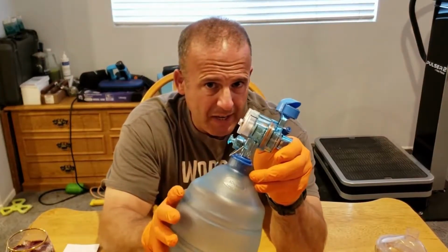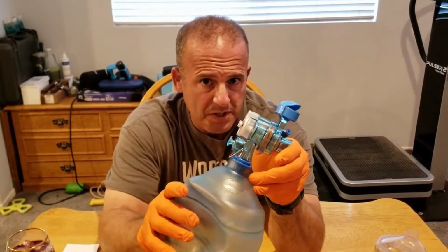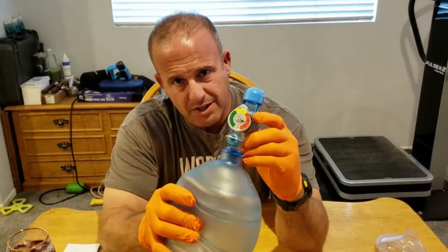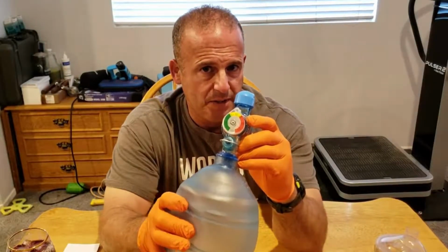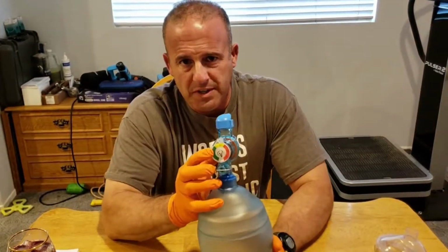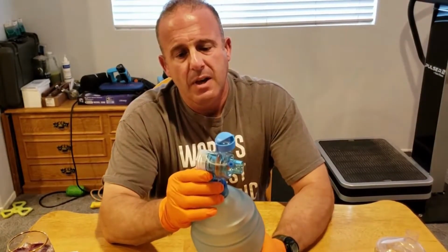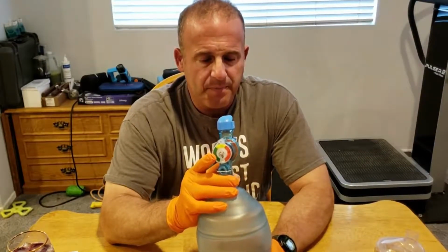If you're bagging a newborn, a neonate, and they had high resistance to breathing, you can bypass that by taking this little clip. And now, no matter how hard I squeeze, you'll see the arrow pegs out in the red zone. And it's a pretty hard squeeze. The ranges are 0 to 20 centimeters in the green, 20 to about 40 in the yellow, and above 40 in the red.